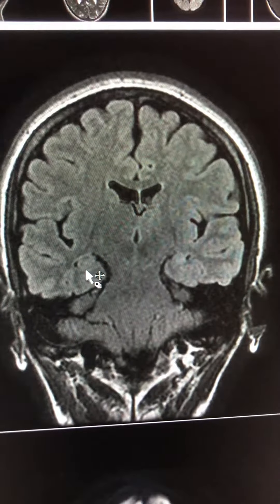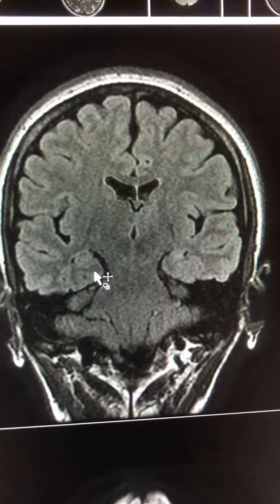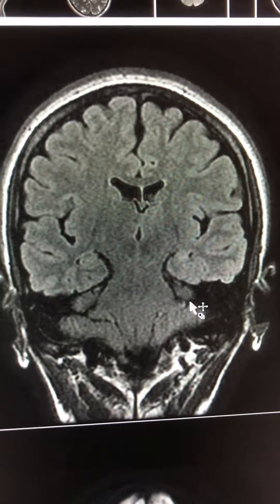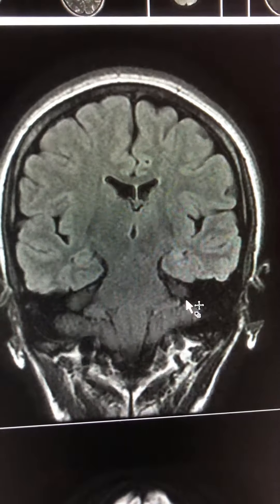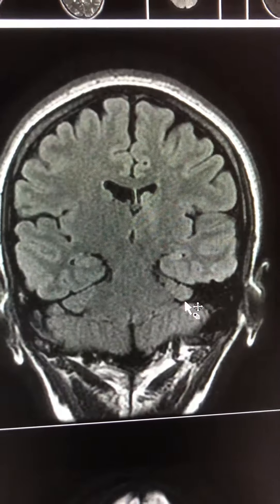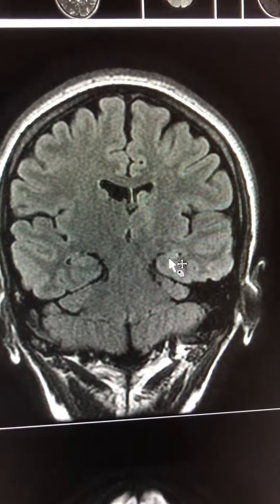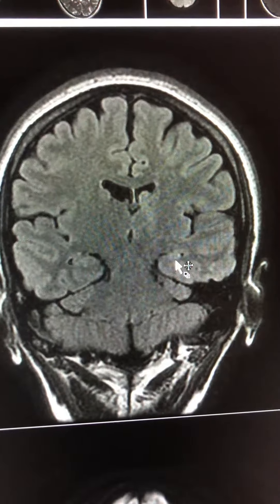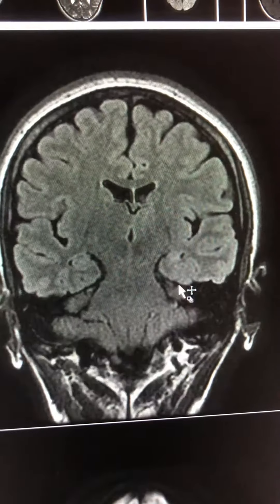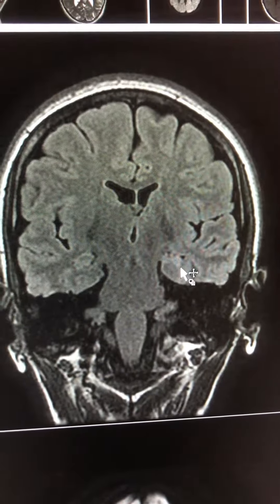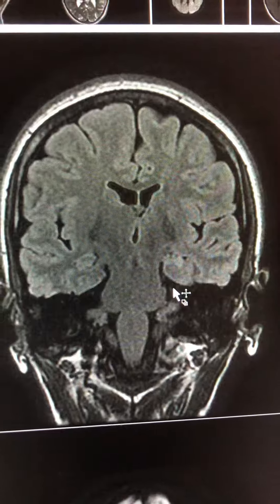On the right, the normal cortex shows signal intensity similar to the rest of the cortex. On the left side, you see that it is thinned, it is hyperintense on FLAIR, and you see loss of volume.